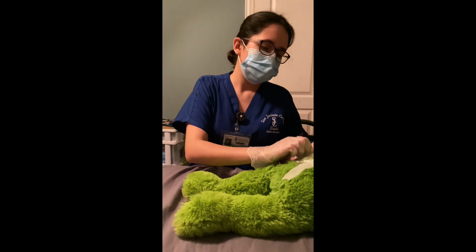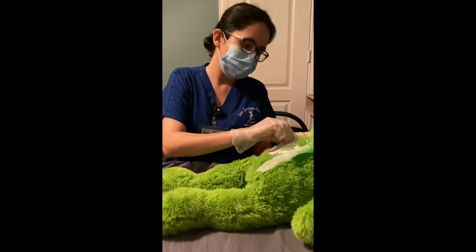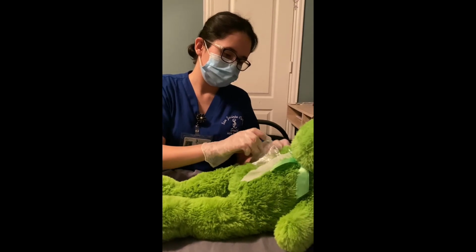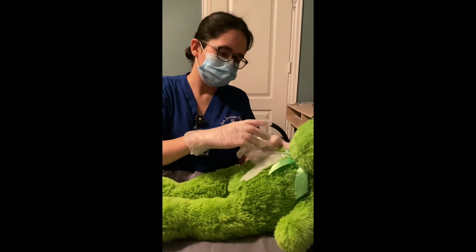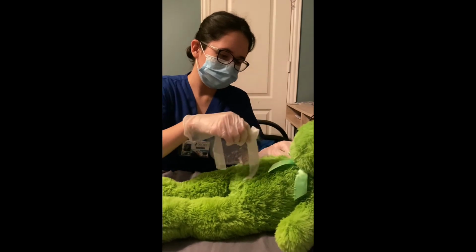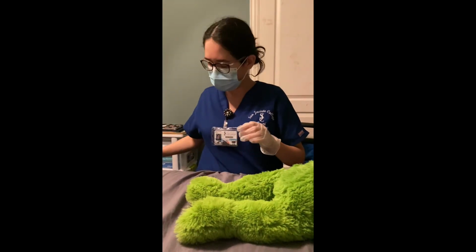So we're going to remove the patient's dressing. We're going to be careful when we are removing the old dressing. Okay. So whenever we remove the old dressing, I'm going to throw it in the trash.